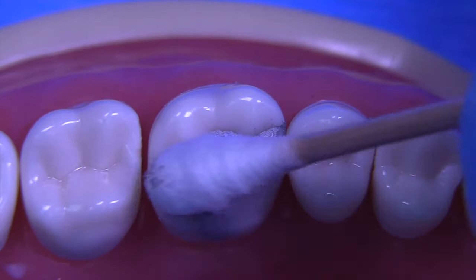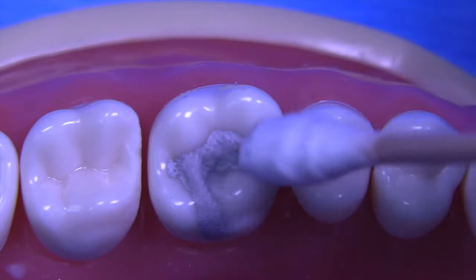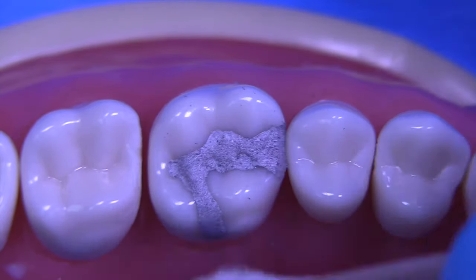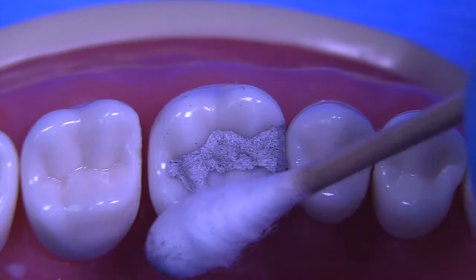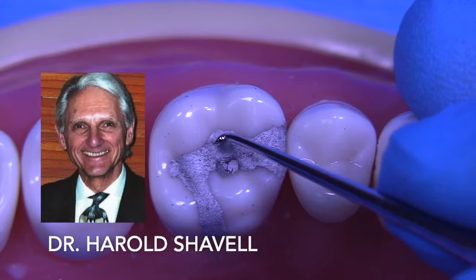There's a significant amount of flash still left on this amalgam, but we're utilizing a cotton Q-tip to remove any excess and to create a smooth surface. This is a really great technique that I learned from Dr. Harold Shavell many years ago.